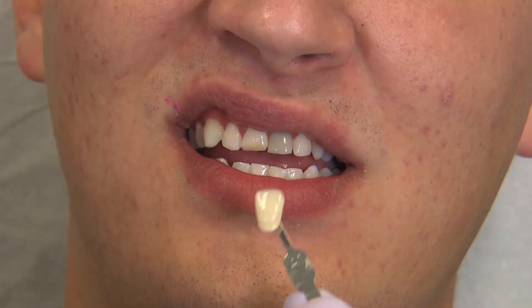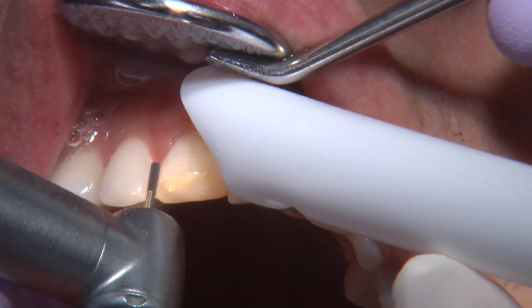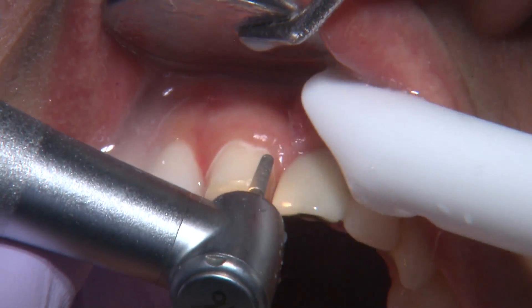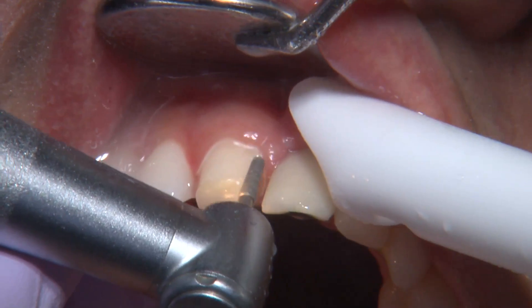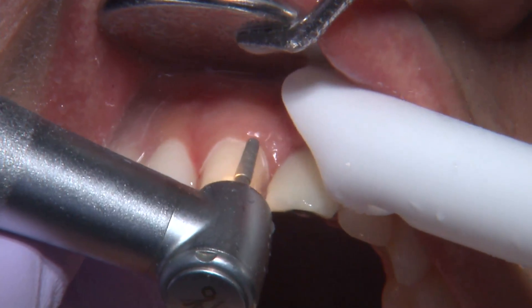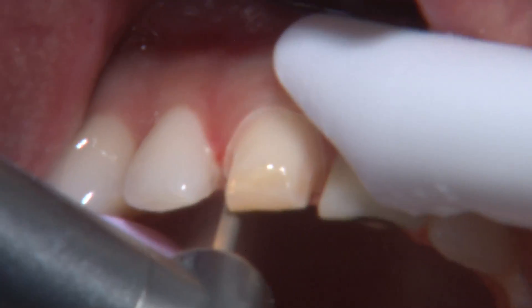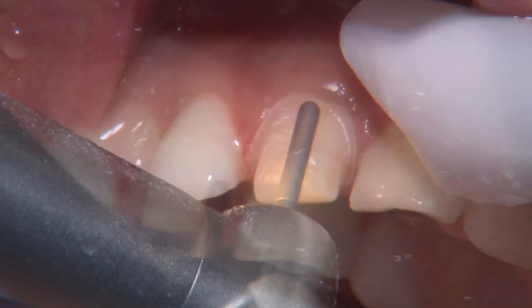I'm a very big fan of getting orthodontics done even before the implant is placed, and we recommend that to most of our patients in this type of situation. The patient went ahead with preparation of the crown on tooth number eight, and on tooth number nine it's still temporized while we let the tissue heal. This is a couple of months after the implant is placed. I'm now ready to take a final impression of both the crown restoration and the implant crown so the laboratory can fabricate our final restorations.